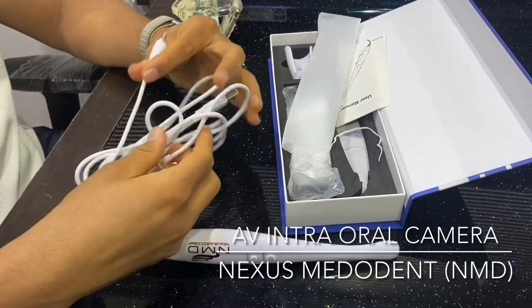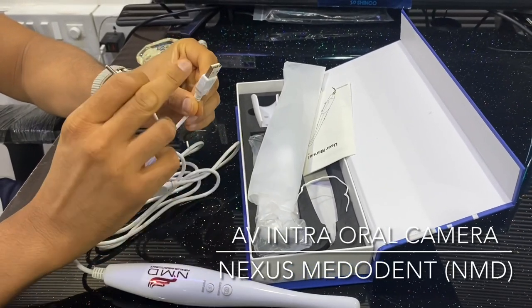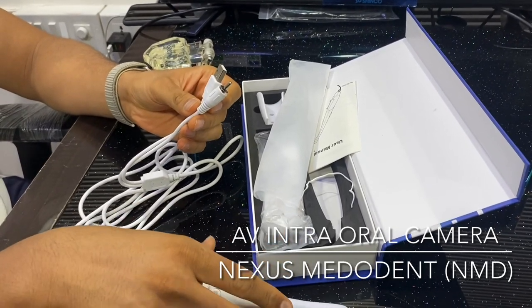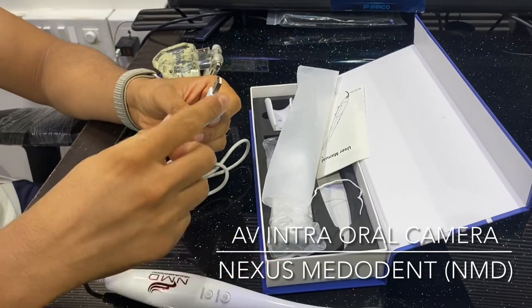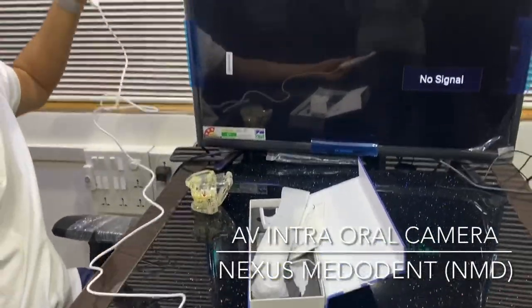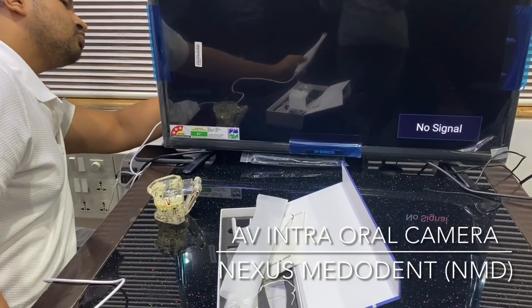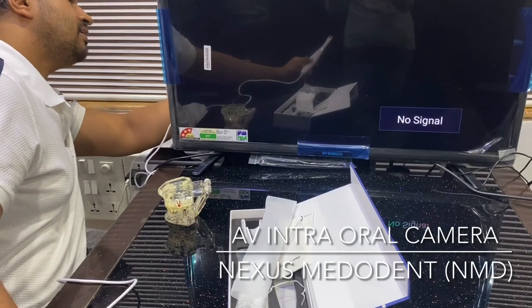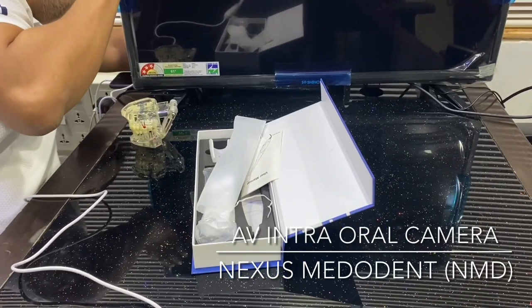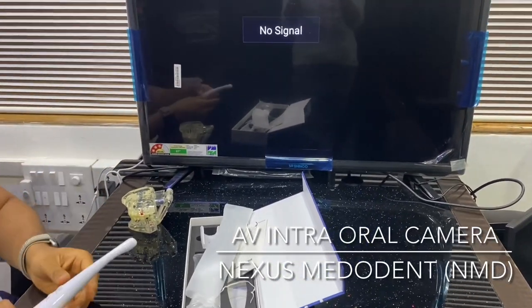Let's open it up. As you can see, there are two connections — one goes into the AV output and the other goes to USB. The USB powers the LED on the camera lens, and the AV connection captures and transmits the image to the TV. The cable is also very long — about a meter, close to three and a half feet. I'm connecting it now — connections are done, let's switch it on.